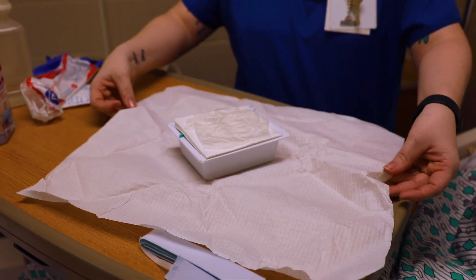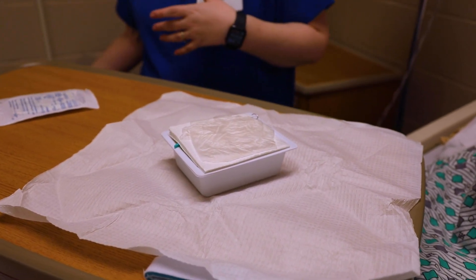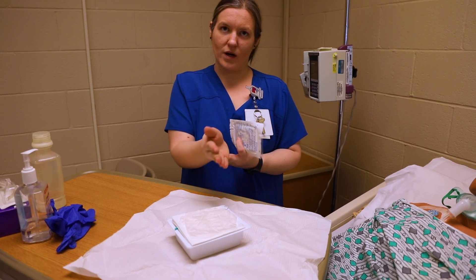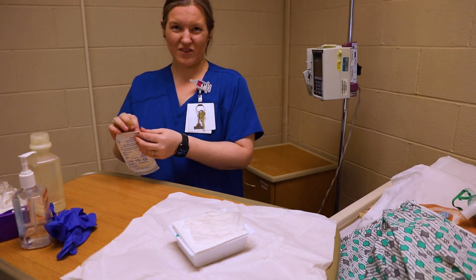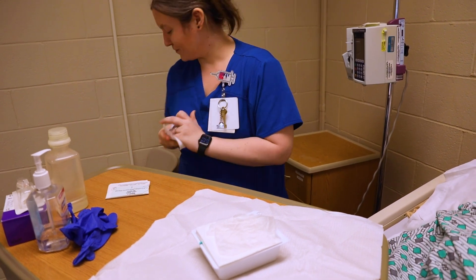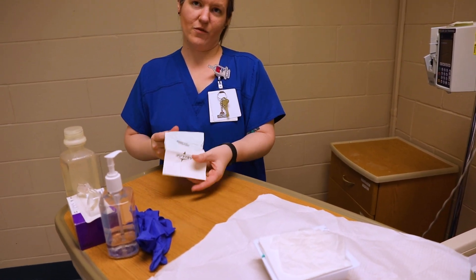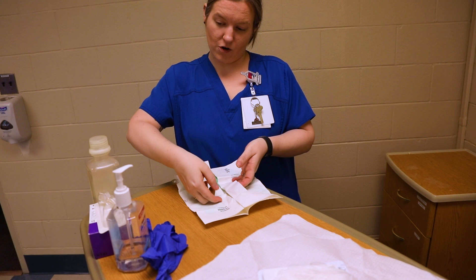Those gloves in the kit — you can use them, but I'm going to use my own gloves. If you use the kit gloves, you can pinch in and pull them out, even though that crosses over your one-inch border. I don't really like those gloves — they don't fit my hands very well. When I use my own, if you watched the sterile gloves video, you can see all the steps, and I'm going to make sure I don't cross over the sterile barrier.